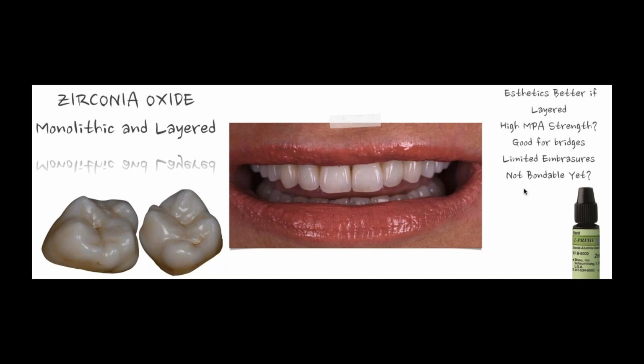So the newer studies that I've seen are showing me that if I took a very translucent zirconia at about 600 megapascal and I etch it for the 20 to 30 minutes that I need to actually start to create a surface, when I'm done, that megapascal strength drops to about 300. And 300 isn't a horrible strength, although it is a horrible strength if you have a very rigid material. So from that point of view, I get a little concerned about how we're managing that.